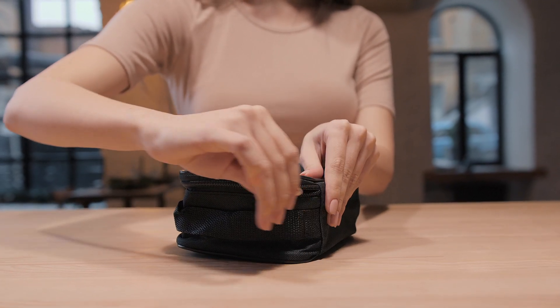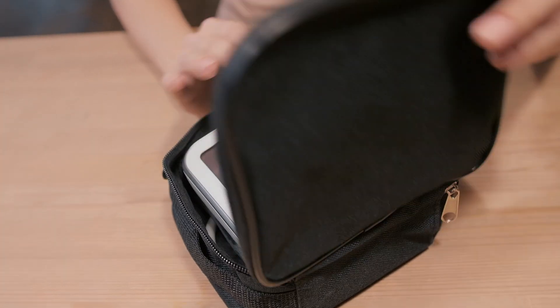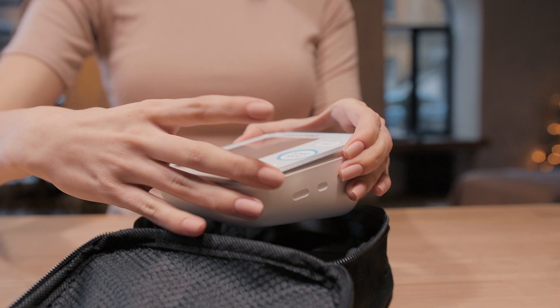Paramed's Automatic Upper Arm Blood Pressure Monitor is comfortable and easy to use. You can check both blood pressure and heartbeat by pressing a single button.